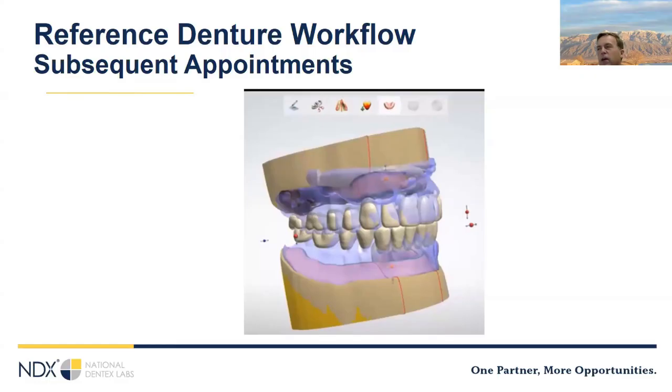It takes a minute to do, most of the time on this is front loaded doing the reference denture scans, but even that you'll find goes faster as you get more experience with it. One thing I would say is that a lot of us, including me, when we started scanning dentures, we started scanning on the cameo surface, and the camera has a hard time going over the borders into the intaglio. So we found in general that it's easier to start on the intaglio and kind of take a broad scan where you're picking up some cameo surface all the way across. So anyhow, that's I would say the best way to do a digital denture today.